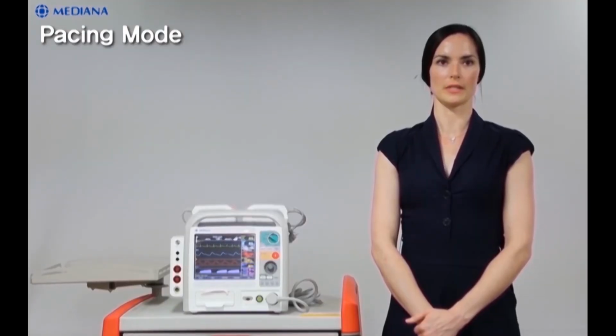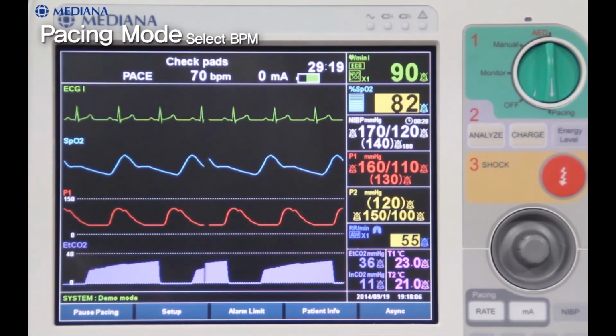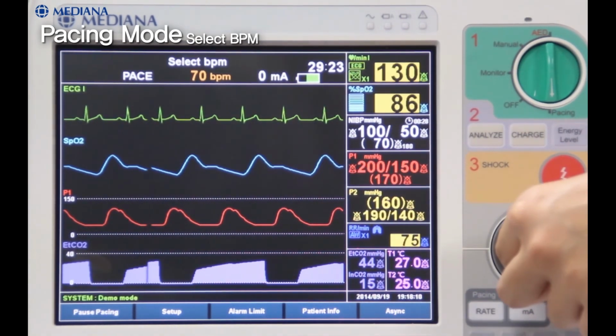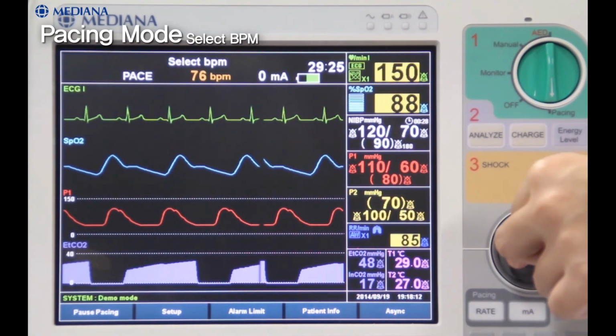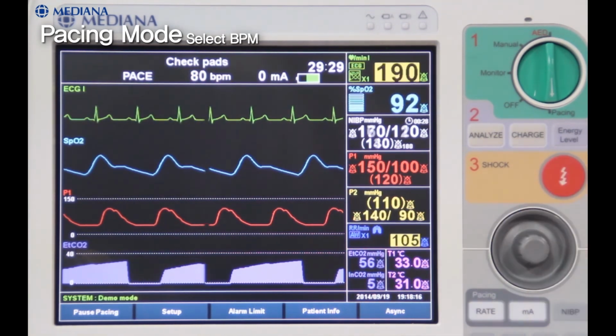When the rate button is pressed, the color of the pulse rate value changes and can be modified. Select BPM is displayed, and by pressing and rotating the multifunction knob, you can select the desired value of the pacing pulse. The value is changed by 2 beats per minute.